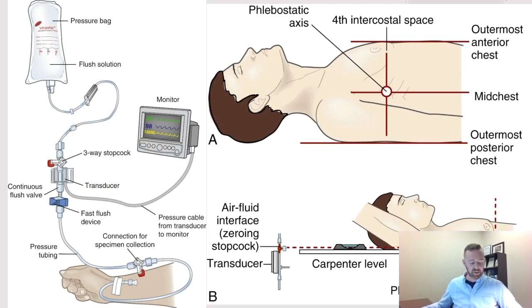All right, so you can get a specialized sensor, and it depends on where you're working, I'd say most places probably have this, that can actually do some extra calculations, and they can calculate a cardiac output and cardiac index based on the data that's being fed into there as well.